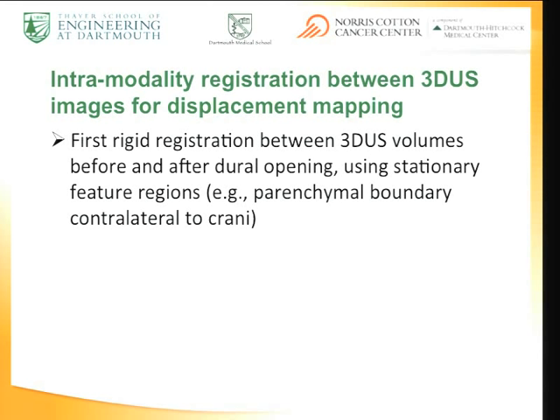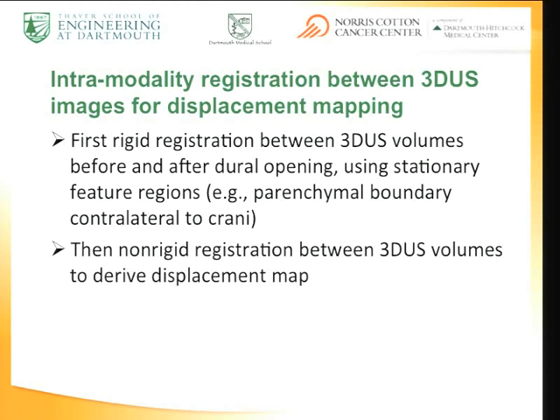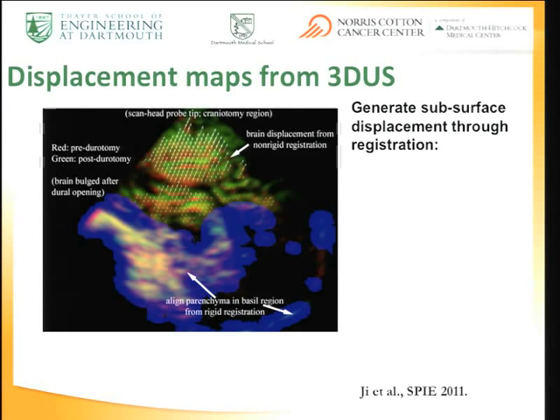then subsequently during the procedure, what we use is information contralateral to where the scan head is, this parenchymal surface on the bottom of the image, because it's pretty stable, as a way of getting out the tracking error. So we first make that registration, and then we do a re-registration of that. I think we're using, if I remember right, a B-spline, producing a nonlinear characteristic off of an MI similarity measure. So here's a picture of it, and Songbai has done a lion's share of this work, and he reported it here to you last year.